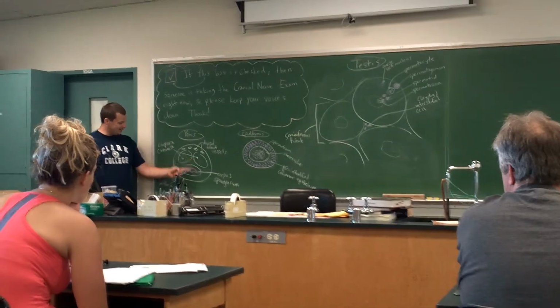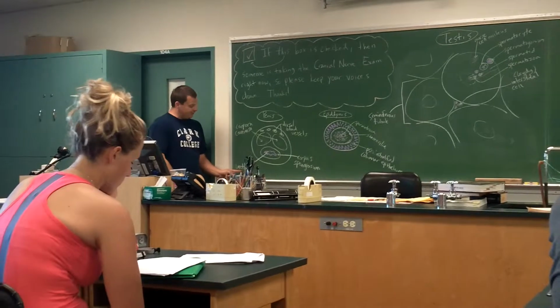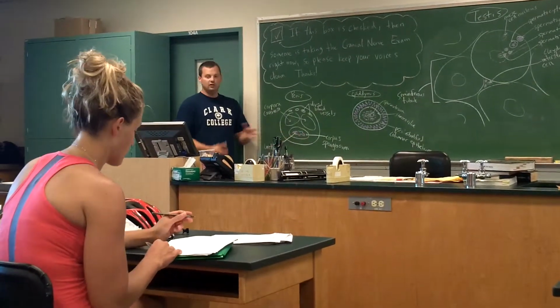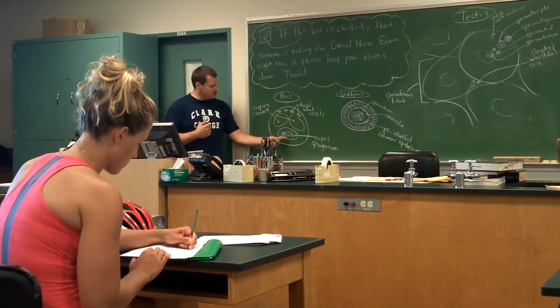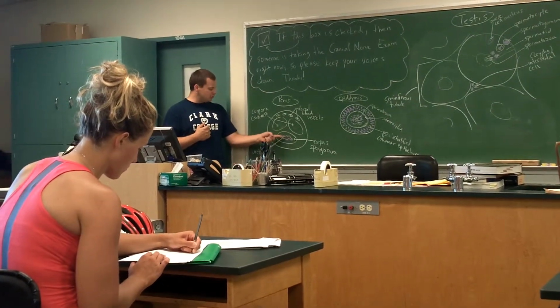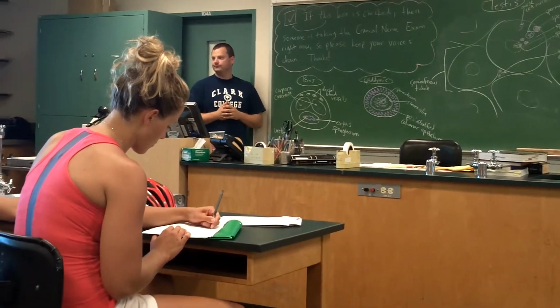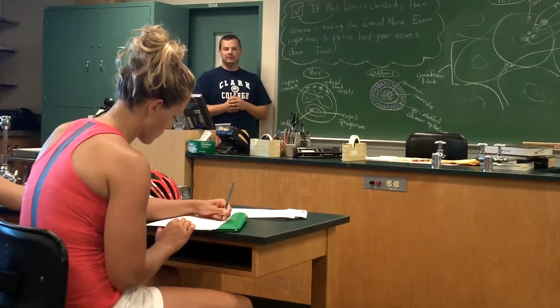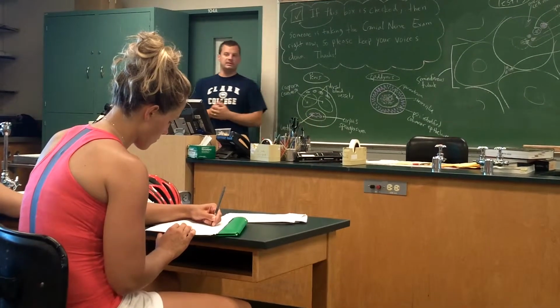You have the two eyes and the mouth and everything like that. It's kind of funny, the mouth of the penis face is the urethra. And you're going to look for the urethra, and how you're going to know it's the urethra is it'll have kind of an undulating, irregular luminal shape, and it's lined by a pretty thick purple epithelium. Now the tissue that's immediately surrounding the urethra is erectile tissue, and that specific erectile tissue is the corpus spongiosum.